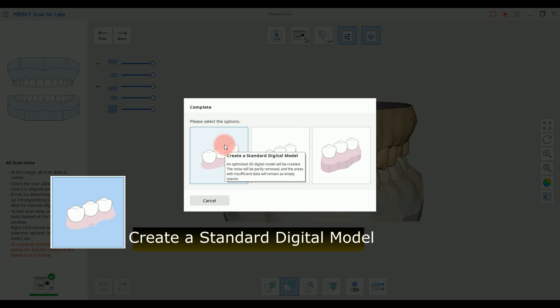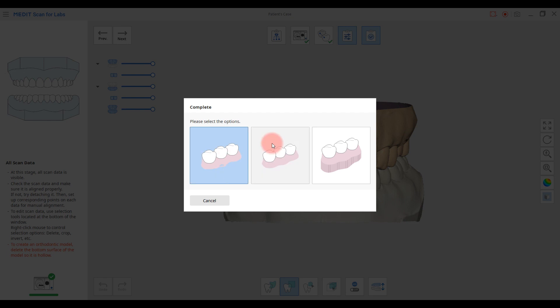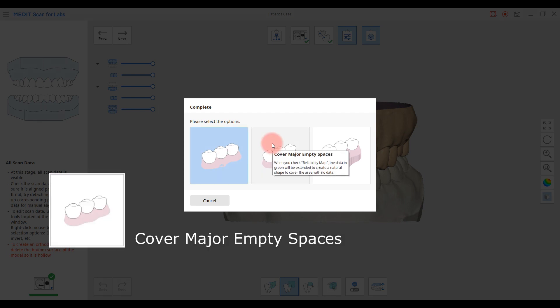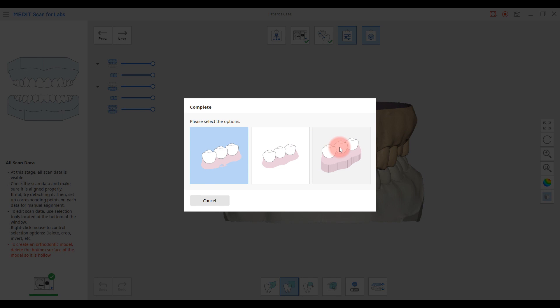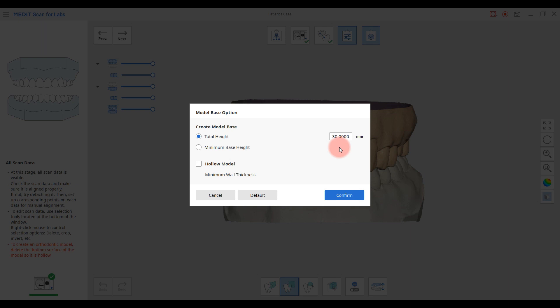Create a standard digital model, cover major empty spaces, and optimize model for orthodontic application. If you select Optimize model for orthodontic application, you can create a model base and a hollow model for 3D printing.